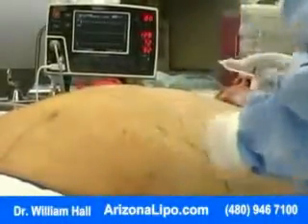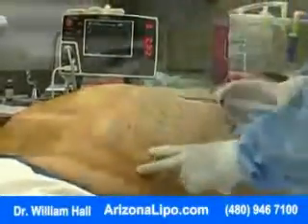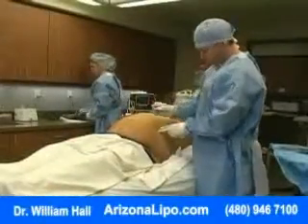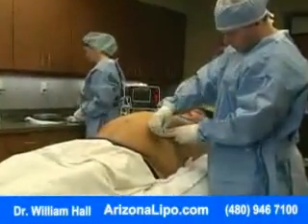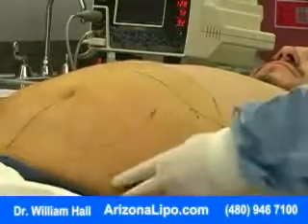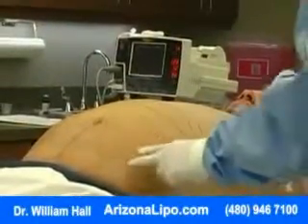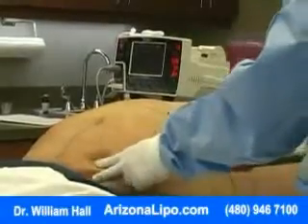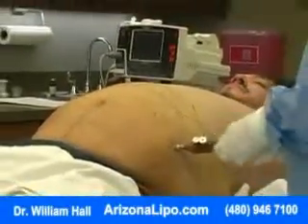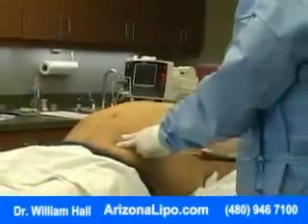Okay, Alex, so we're going to put tiny little injections where I'm going to put my incision sites, okay? You can barely feel this at all. So 4 total on the abdomen. And you'll mostly just feel a little bit of stinging sensation here and there, but not too bad, is it? This is a combination of the local anesthesia, the salt water, and the epinephrine that we talked about. So it's doing 2 things. It's numbing the area so you're not going to feel anything when we do the suctioning, and it's also restricting the blood vessels so that there's hardly any blood loss in this procedure.